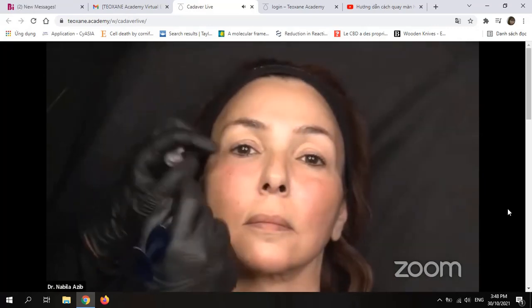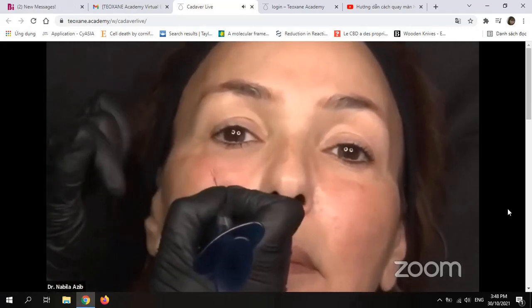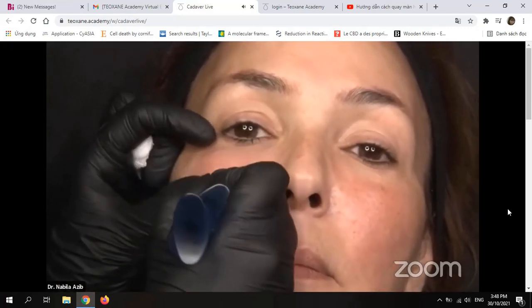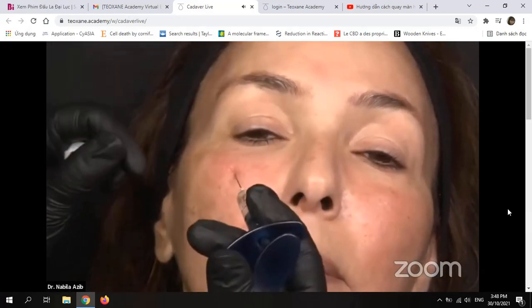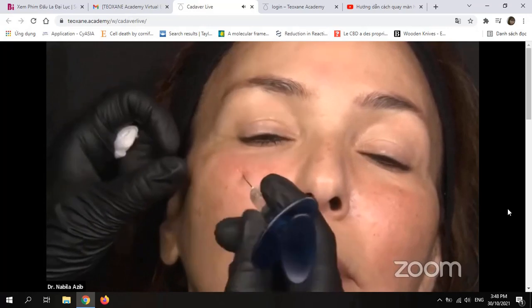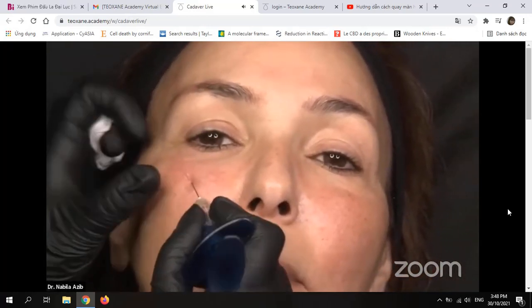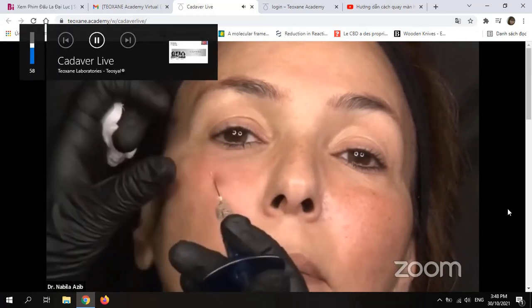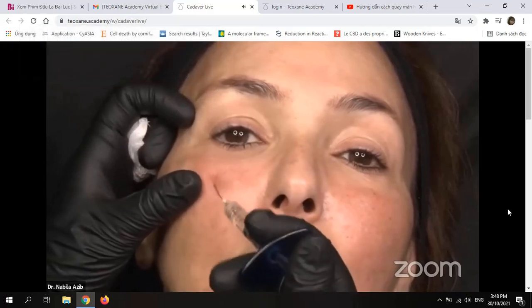From the same entry point, I change the direction, I press again the ligament, and now she will probably hit me because I will slide on the bone again. But now I will not inject boluses. Look, Ludmila, I will be injecting retrograding lines and anterograding lines. I try to create a pocket with my cannula.